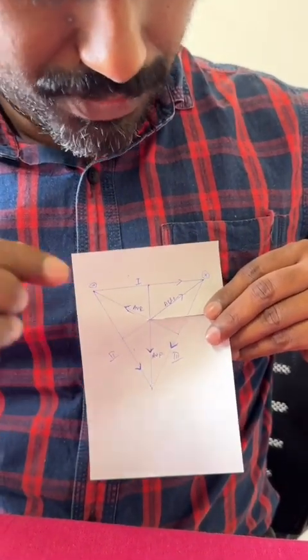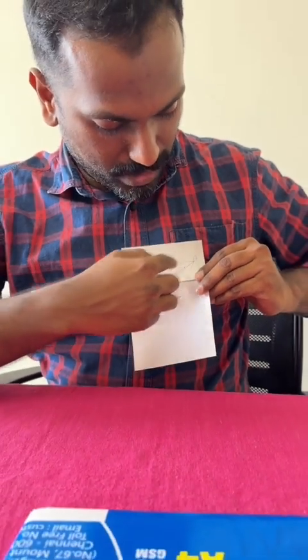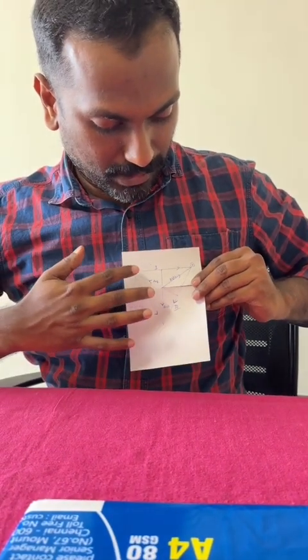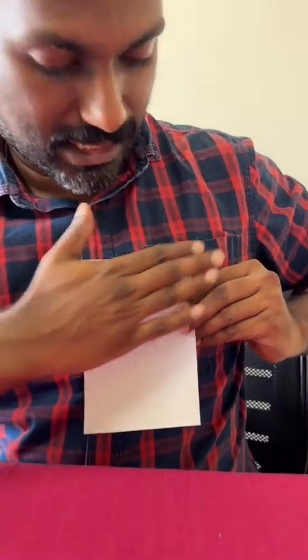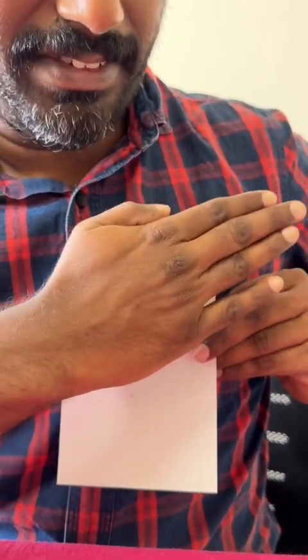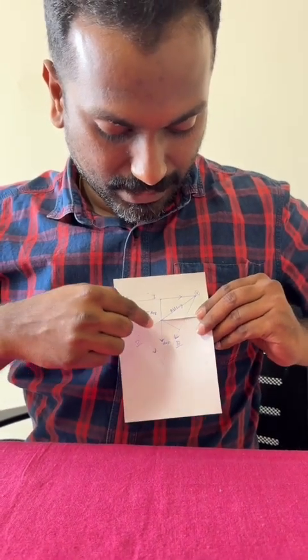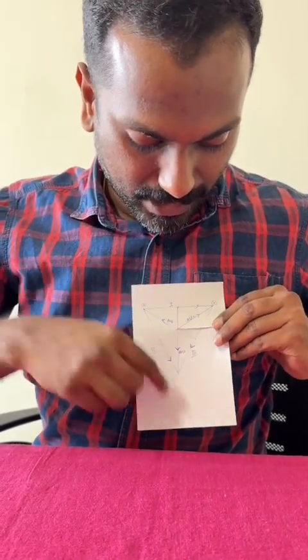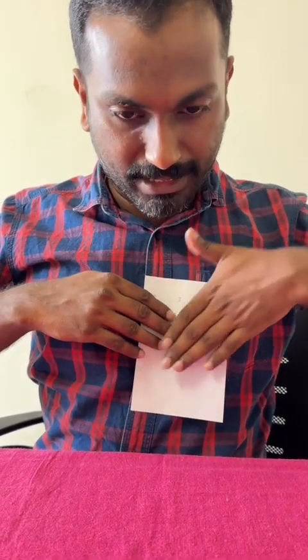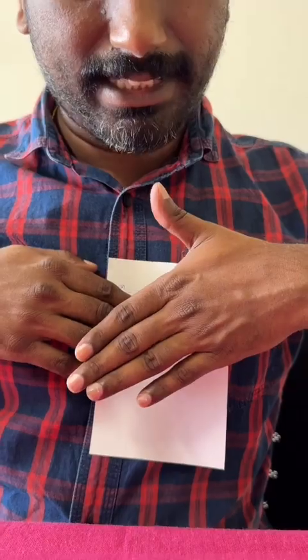So what if you are seeing the biggest R waves in lead 1 and AVL? So the biggest current is in this direction, so we can see the heart is oriented this way. So that is left axis deviation. And what if the biggest deflection is in AVF and 3? So the direction will be like this, so the heart is turned to this direction. That is right axis deviation.